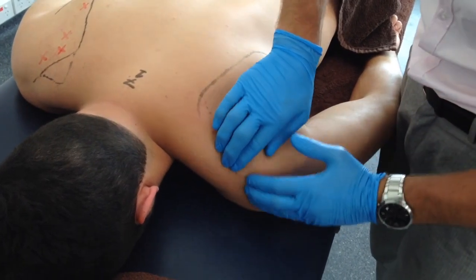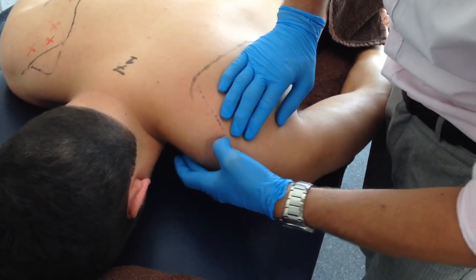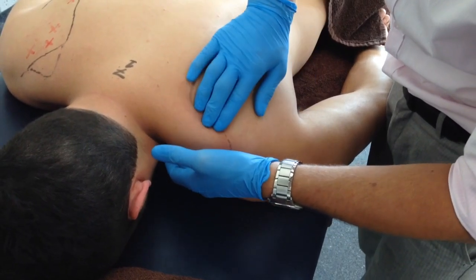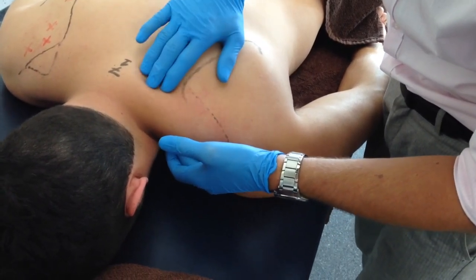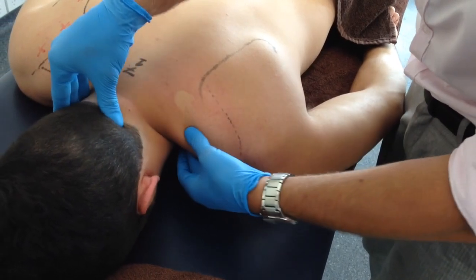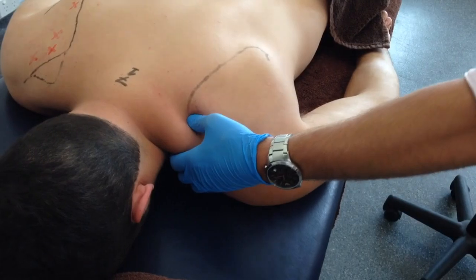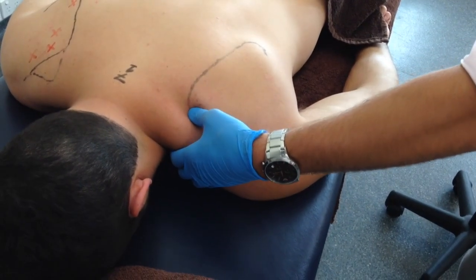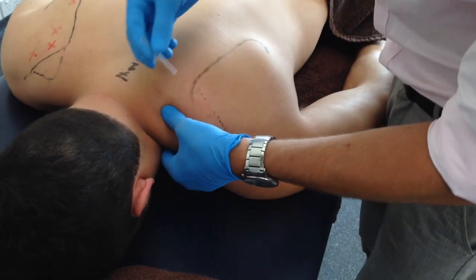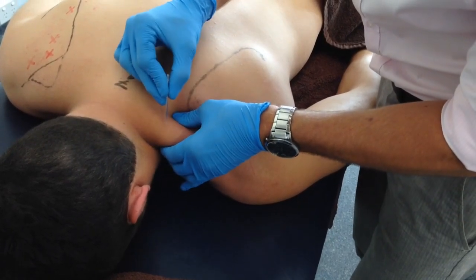With the patient in the prone position, this muscle should be needled in a posterior to anterior direction. Pneumothorax, as a result of the needle penetrating the lung, is probably the most serious adverse event possible in the area. To minimise this risk, the needle insertion or any needle manipulation should be done with a pincer grip palpation of the muscle belly.